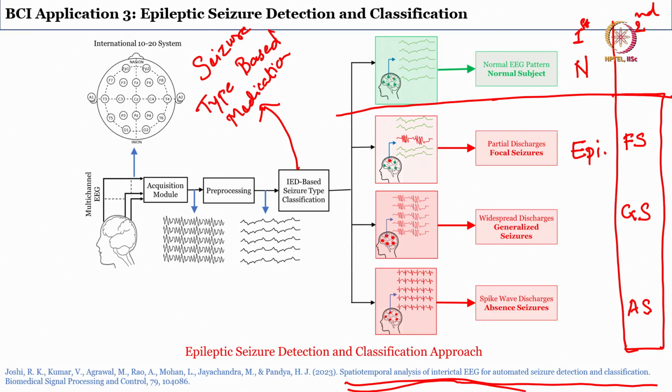So, you can see spatially also I have shown 5 traces and 5 locations, where all of them seem like baseline EEG within the range. This is what I am talking about. Now, let us talk about this case.